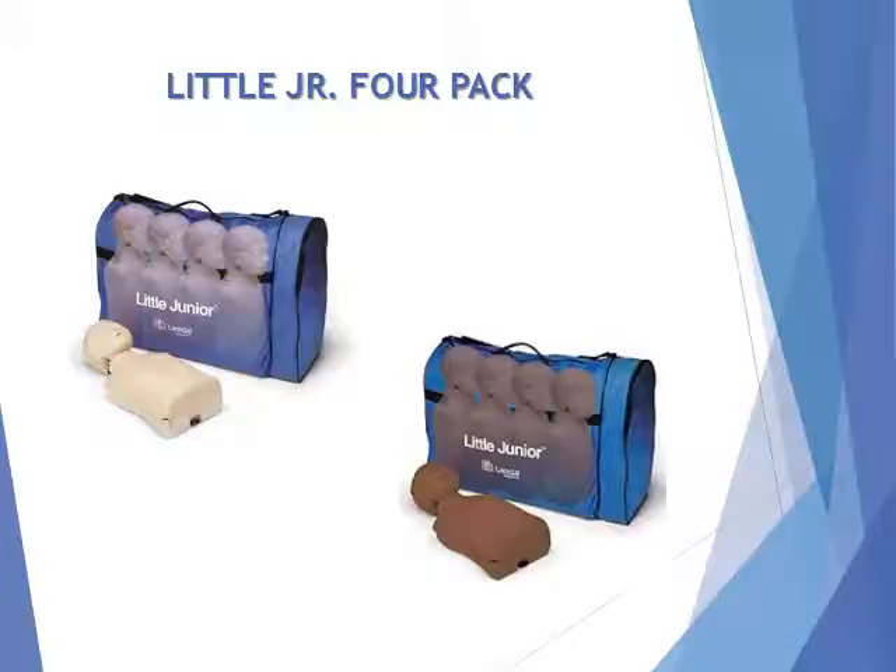Includes 4 Little Junior Mannequins, 4-Pack Carry Case, 8 Junior Faces, 8 Junior Airways, 24 Mannequin Wipes, and directions for use.